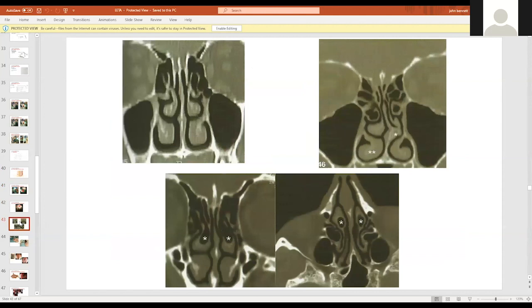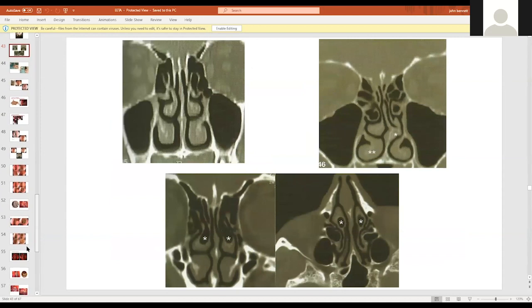Okay, as I said again, we need to really understand how the middle turbinate and inferior turbinate are located, and this narrow corridor between the nasal fossa and the turbinate, you need to expand it. You really need to expand it and be more comfortable introducing your suction, your telescope, and another instrument. So in regular practice, what we do is a binostral approach. Some people just prefer mononostral, but we don't really see any significant difference. But it increases your comfort when you do a binostral approach.